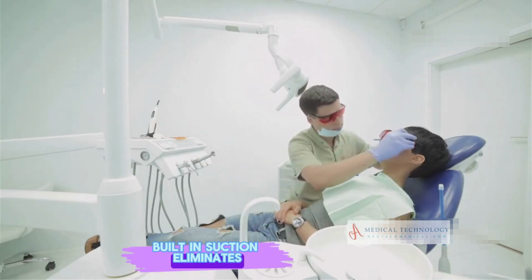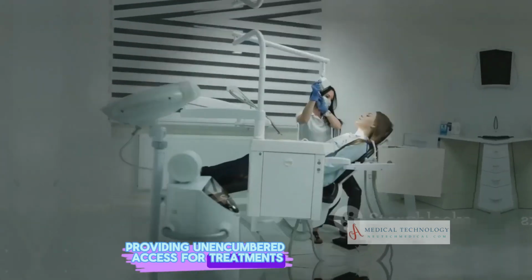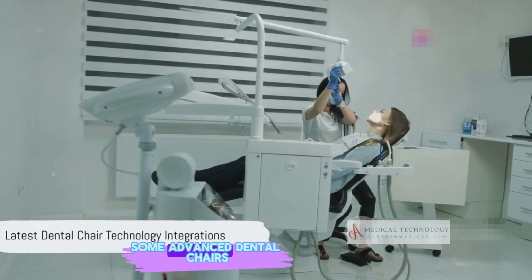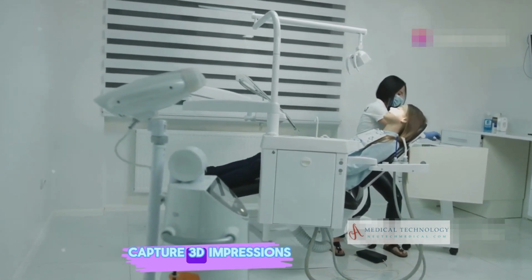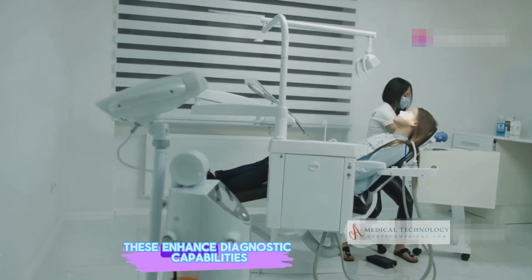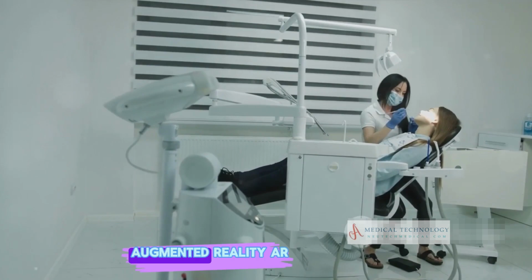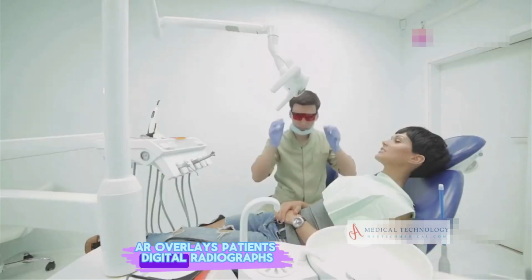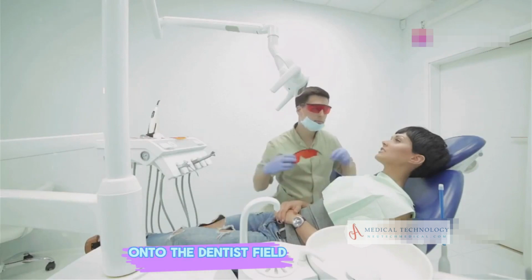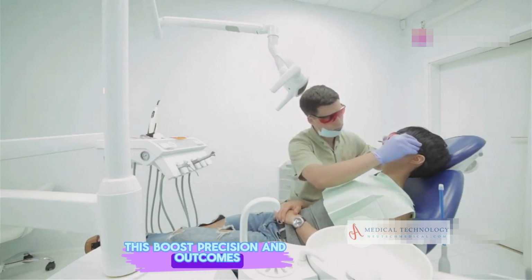Built-in suction eliminates external tubes, providing unencumbered access for treatments. Integrated 3D imaging. Some advanced dental chairs feature integrated intraoral scanners that capture 3D impressions. These enhance diagnostic capabilities and treatment accuracy. Integrated augmented reality, AR. AR overlays patients' digital radiographs onto the dentist's field of vision during treatment. This boosts precision and outcomes.